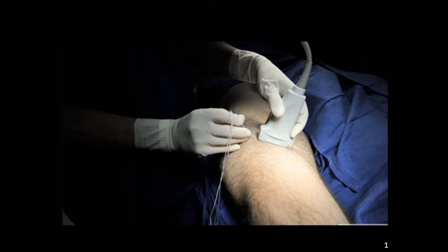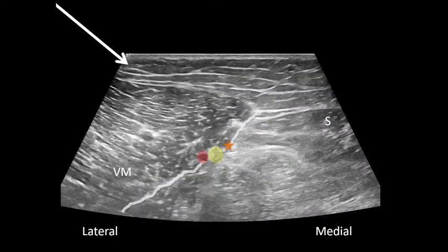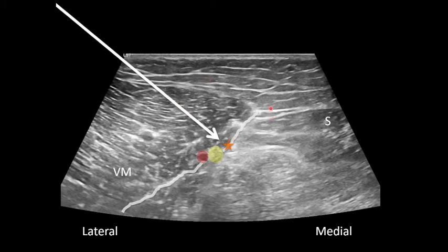Once all the relevant anatomy is identified, you can set up to perform the block procedure. The needle is inserted from the lateral aspect of the probe and is followed using the in-plane technique. This animation shows the trajectory of the needle coming from lateral to medial. The target of your needle tip should be the fascial plane just medial to the saphenous nerve. If the needle tip is placed in this location, injection of anesthetic should separate the fascial plane and fill around the saphenous nerve.